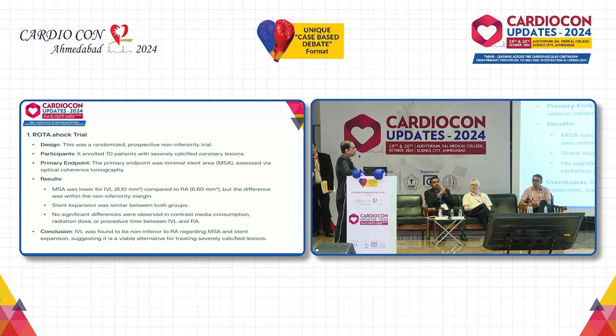So basically, as of now, it's primarily because of the non-inferiority design of the trial. It was not statistically significant. It had to do 85% of the cutoff of the superiority margin, and it was within 85% of RA. So statistically speaking, it's non-inferior to RA. But the most important is you should be able to cross with the IVL. Because when there is heavy calcification, you will not be able to cross with the IVL. If you cannot cross, you can't use it.